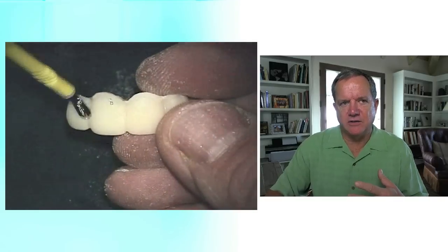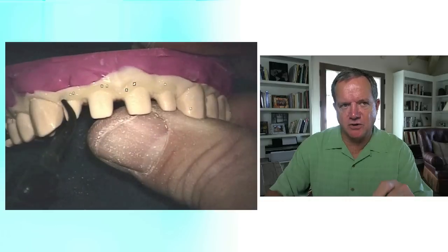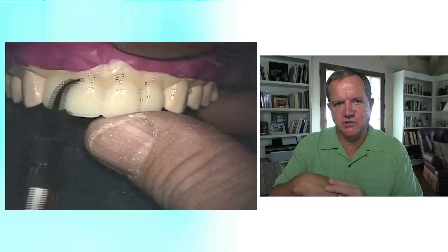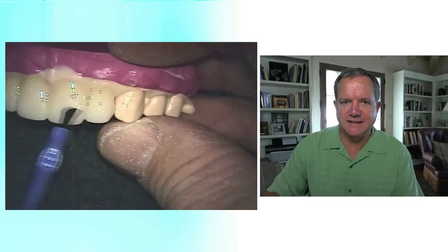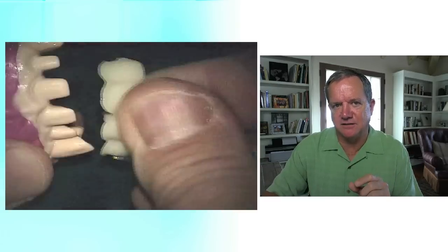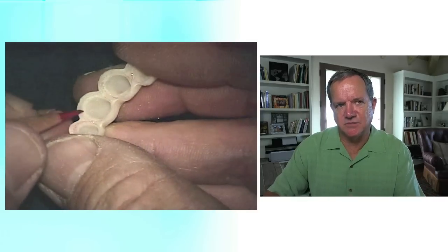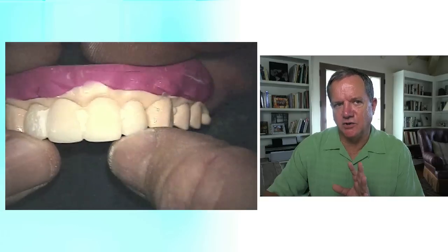So this is what it looks like: it's air-abraded, you paint some adhesive — any kind of light-cured adhesive is fine. There's the flowable being injected in a small amount right along the margins. Seat the temporary on it, it compresses the flowable against the margin. If you want to change any contour, you can do it with just a little more flowable and a paintbrush. Then go ahead and light cure that. Now put it back in the alcohol, mark it with the red pencil, and this time you'll really be able to mark the margins very well because they're captured very well. Now you've got a nice extension past the margin, so you can get a really distinct line, and using that same burr you get a great fitting temporary.